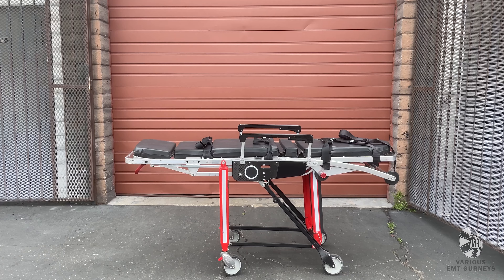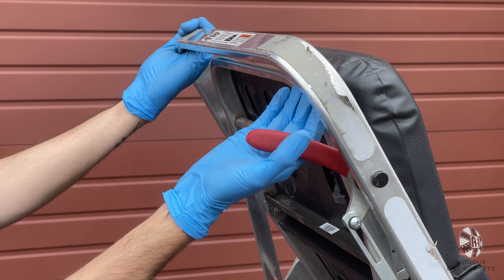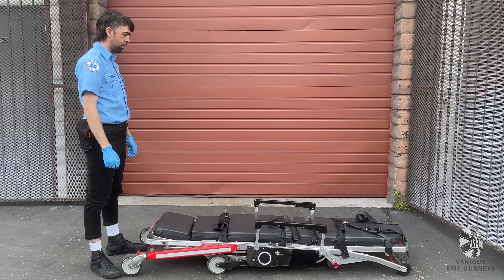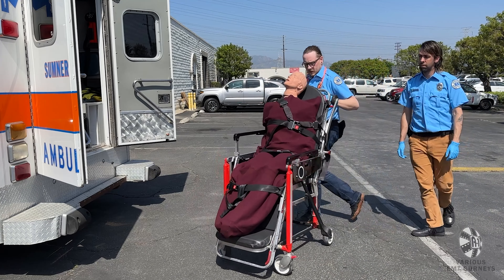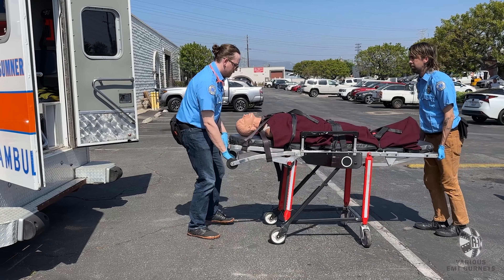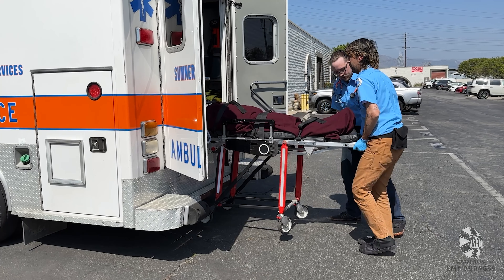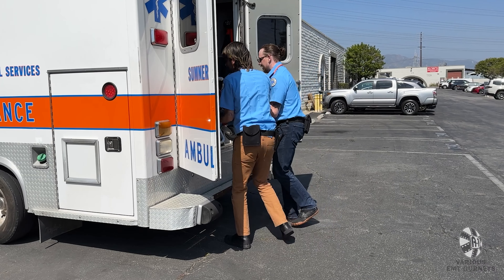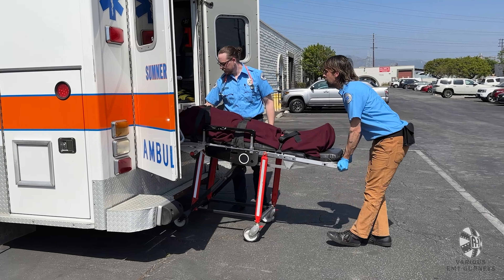If you want to lower the gurney without using an ambulance, you will need just one person and an empty gurney. Tilt up until the loading wheels are on the ground, pull the release lever, and then slowly lower the gurney into the folded position. If you want to raise the gurney with just one person, tilt up until the undercarriage has locked into place. If you wish to load the gurney into an ambulance, make sure the gurney is at its topmost position and fully reclined. Push the gurney headfirst into the ambulance until the loading wheels are inside. Pull up on the foot end of the frame until the transport wheels lift off the ground. Pull the release trigger and slowly push the gurney the rest of the way in. To unload the gurney, grab the foot end of the frame and begin to pull, allowing the undercarriage to slowly drop to the ground until it locks into place.